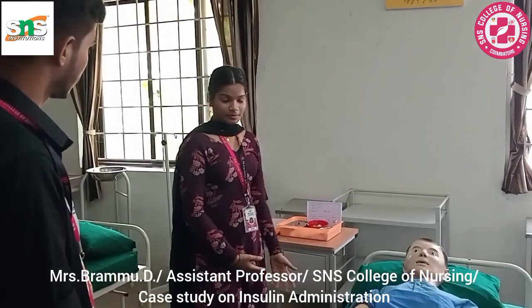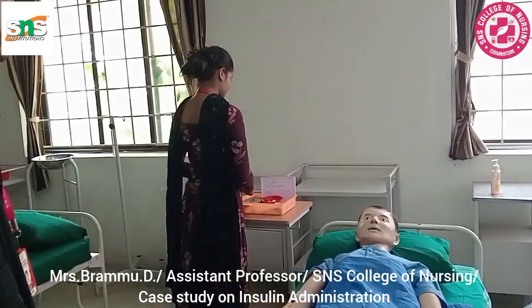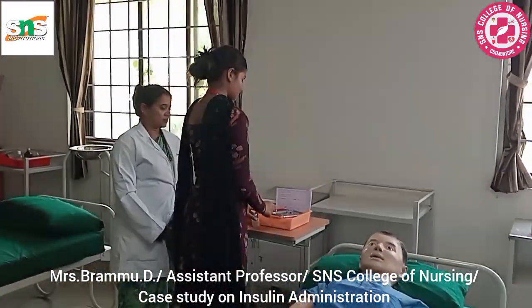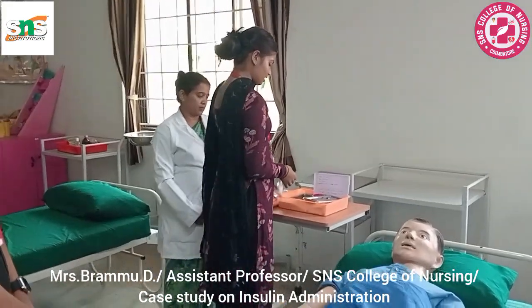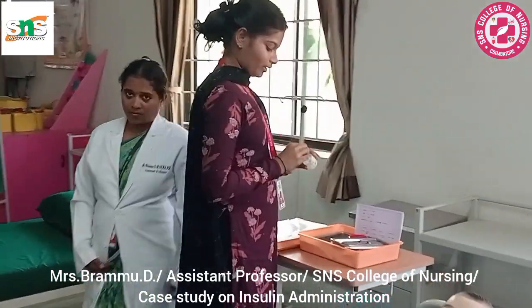Over to you, Atila. Firstly, we need to explain the procedure to the patient and take the articles to the bedside and provide privacy for the patient. First, we need to take the vial. First procedure, before touching the vial, take the vial and decontaminate the opening of the vial using cotton.